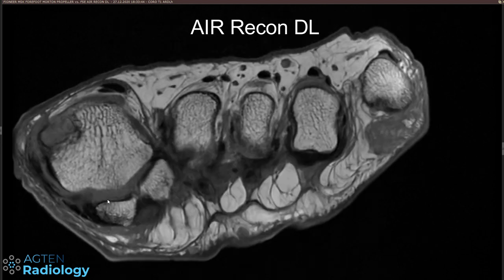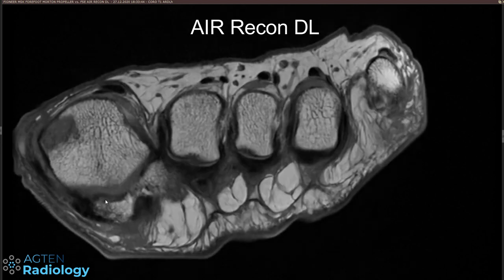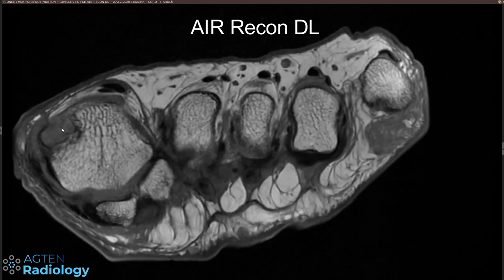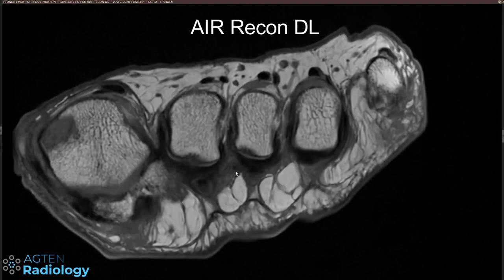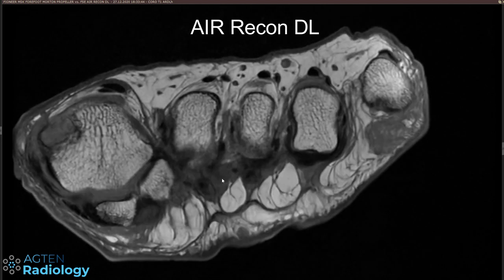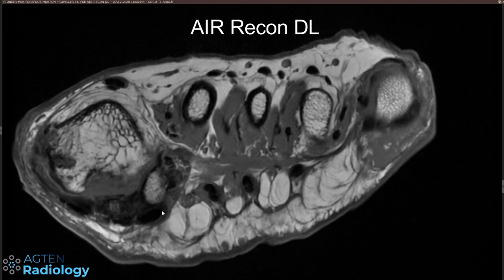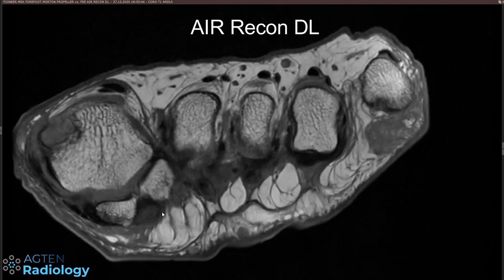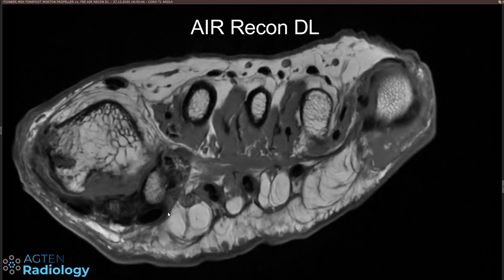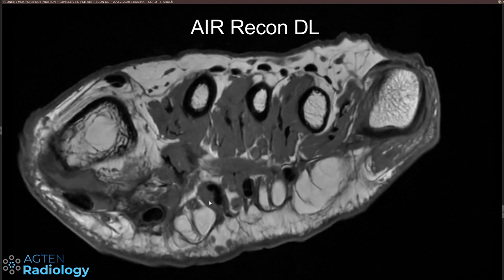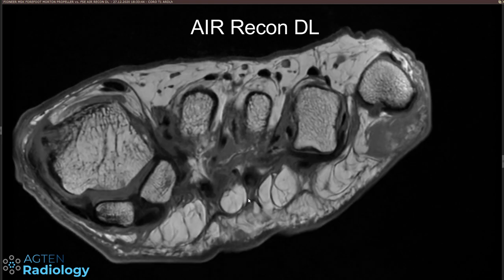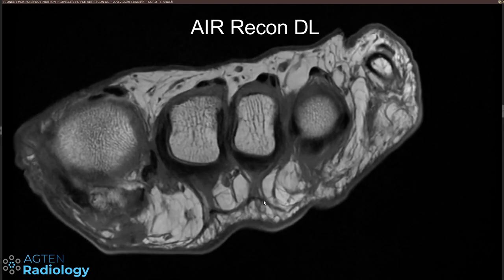Being a T1 sequence, there's not really a great sequence to demonstrate pathology, but I think the anatomy is really nicely depicted.